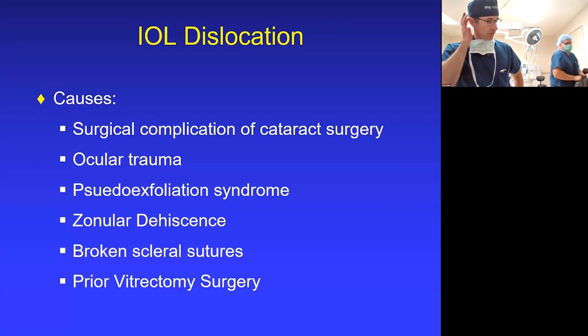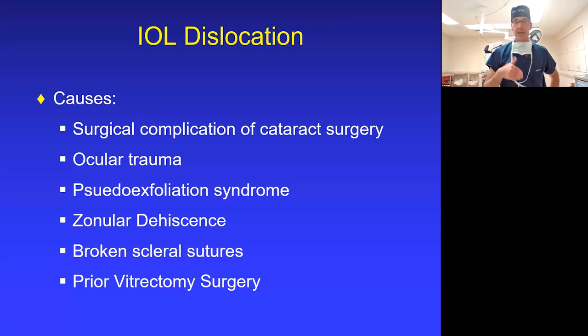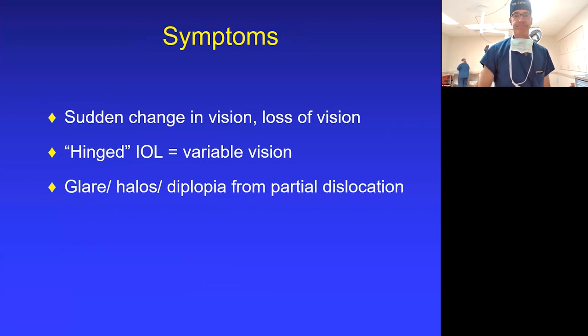And it seems like with the advent of vitrectomy surgery being used primarily for retinal detachment repair over scleral buckles, we're getting more zonular dehiscence and lysis. People are scleral depressing, shaving the vitreous base, working on peripheral PVR. So especially patients who've had two or three vitrectomies to repair retinal detachment, we're seeing dislocation 5-10 years later. And I'm sure it's related to the zonular dehiscence in those cases of multiple pars plana wounds being created.